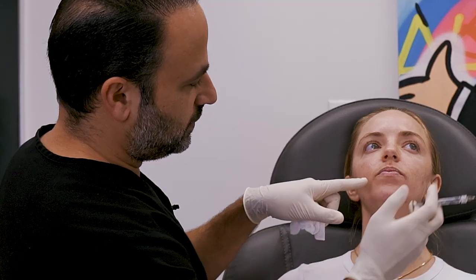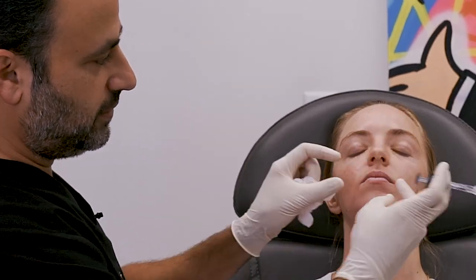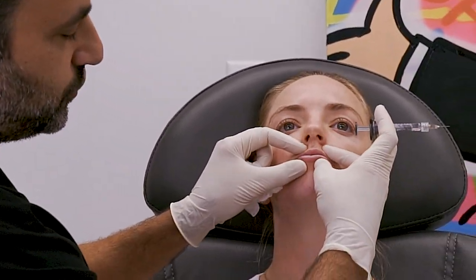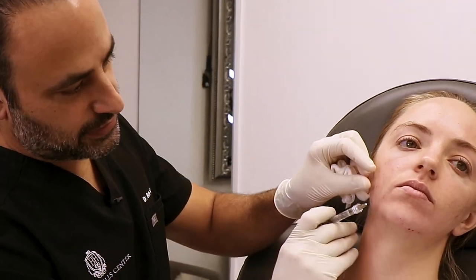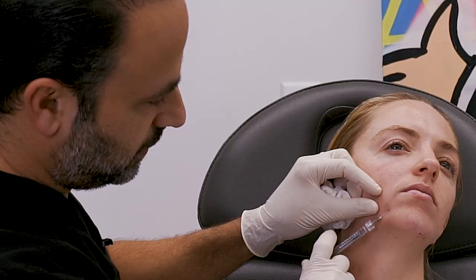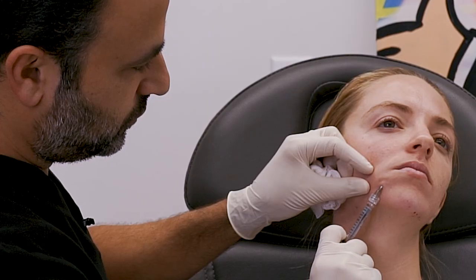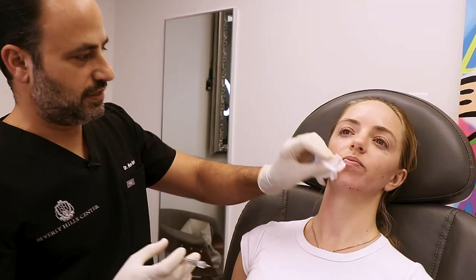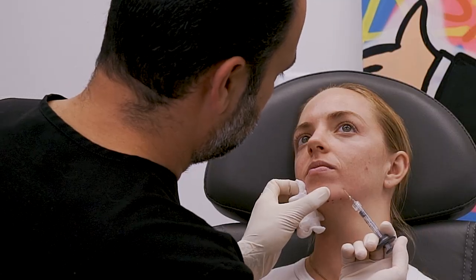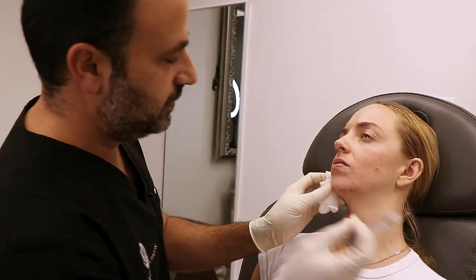That looks fantastic. She needs a little bit of neurotoxin over here, which I'll put later. That's because she has prominent teeth and to close her mouth she really has to stress, so these areas end up getting indented. Because of that, I'm going to put a tiny bit right here where the depressor anguli oris indentation happens. You can inject antegrade or retrograde — it does not matter. Same thing: we want that same angle and a tiny bit in the subdermis and you're safe.